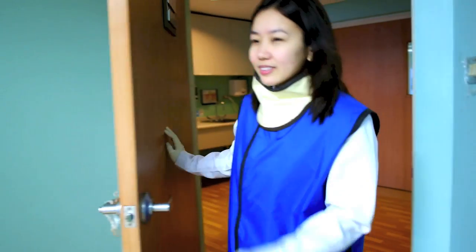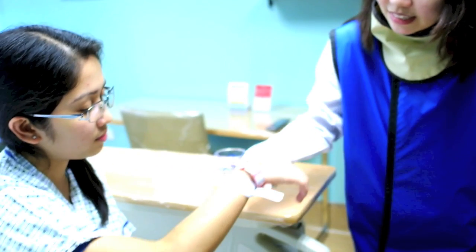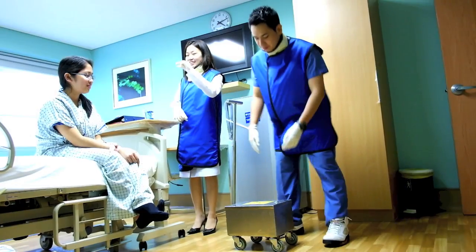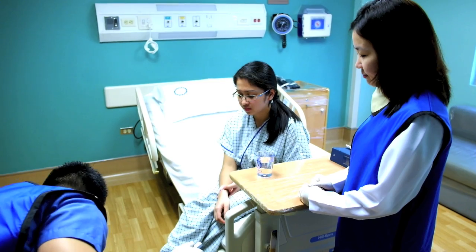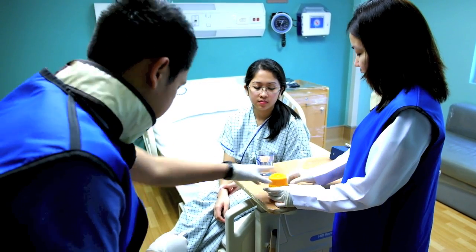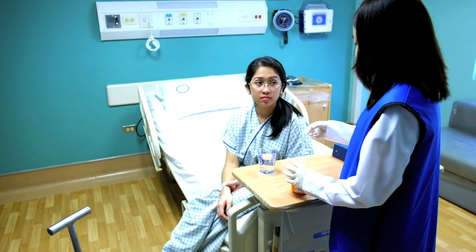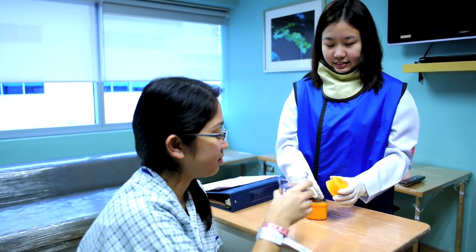When the technologist arrives with the radioactive iodine, the referring physician shall confirm the patient's identification using the SLMC Patient Identification Scheme. Administration of Iodine-131 shall be performed by the referring physician, more technically known by regulation as the authorized user.